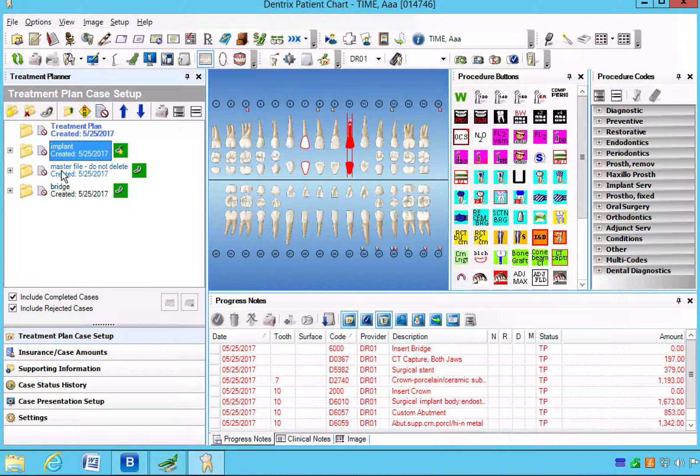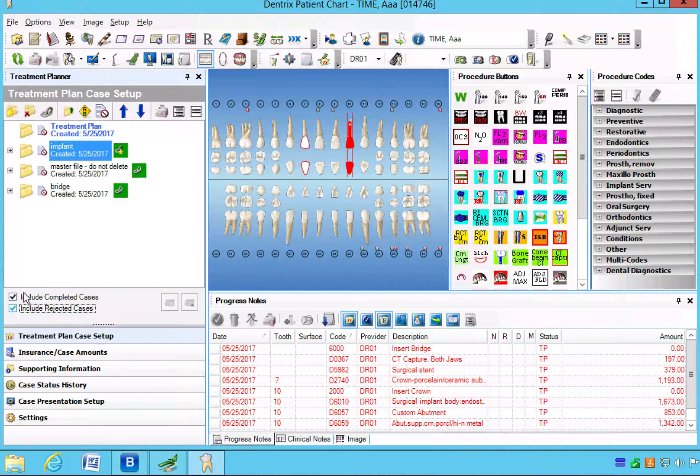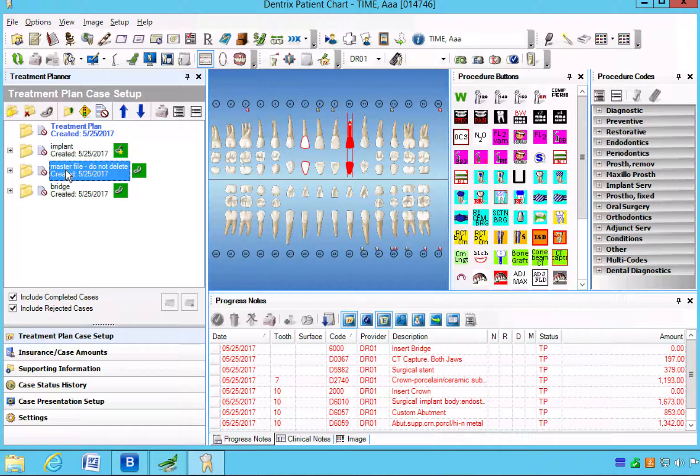So the master file is still there, has not been rejected. The bridge is still there, has not been rejected. Now these typically would get rejected by the treatment coordinator.